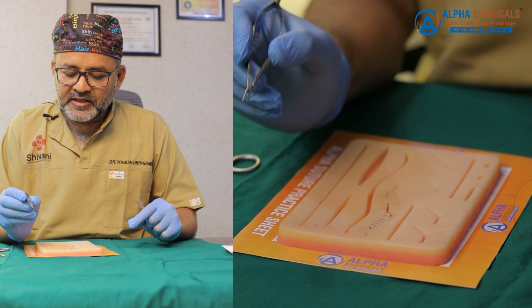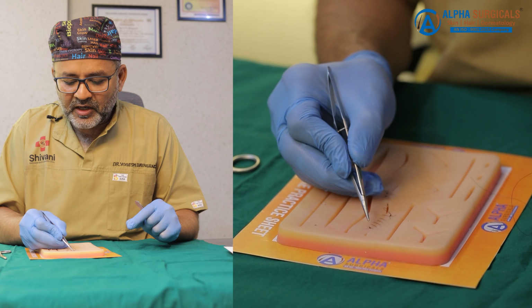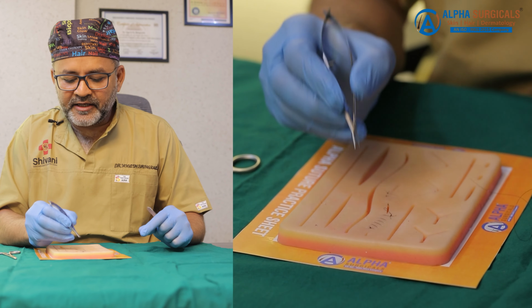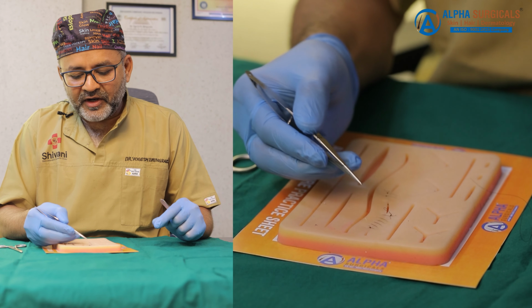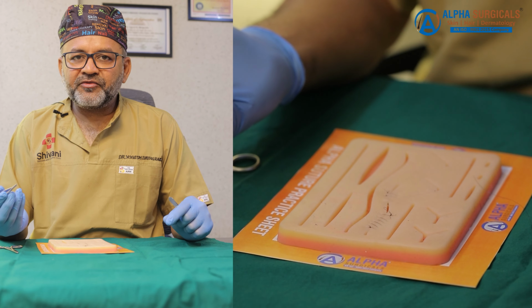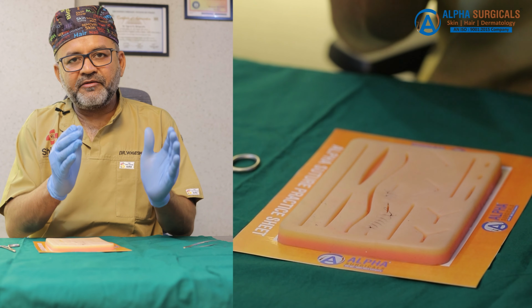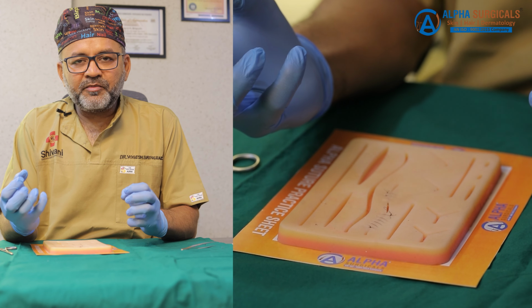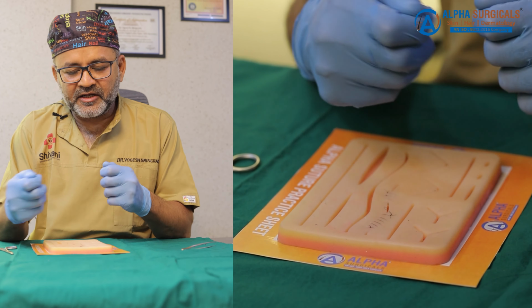The benefit of the running continuous suture is only 2 knots, on either end, and it will not create pressure. Not creating pressure will not give you strangulation of the vessel, so your vascularity will be maintained. Comparing it with the simple interrupted suture, pressure is created in each individual interrupted suture, so there will be a strangulation effect and pressure created while we give the knot.